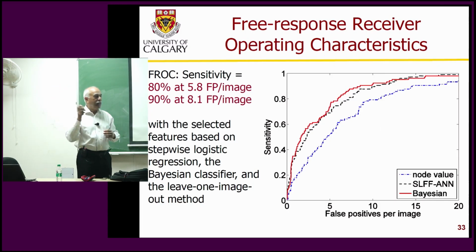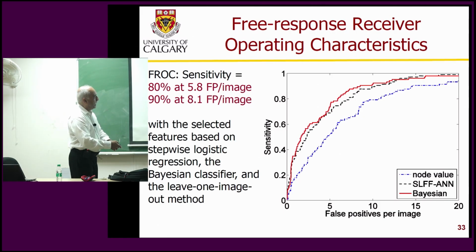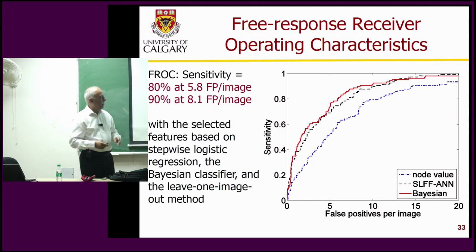So I have to reject false positives and try to increase the sensitivity and pull back the number of false positives. That is, take this curve up towards this corner. It should ideally go straight up, give you a sensitivity of 1 with 0 false positives, and then that remains. So it should be 2 straight lines like that. That doesn't happen in reality.